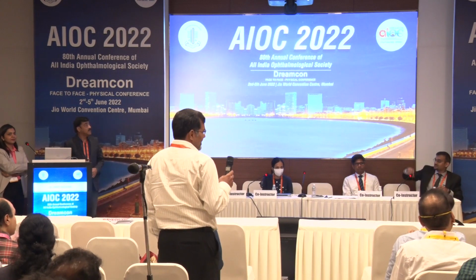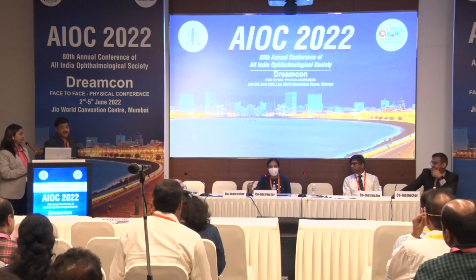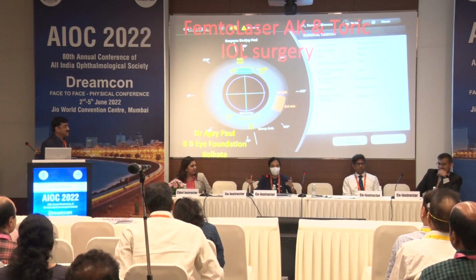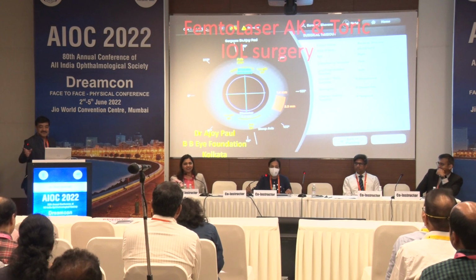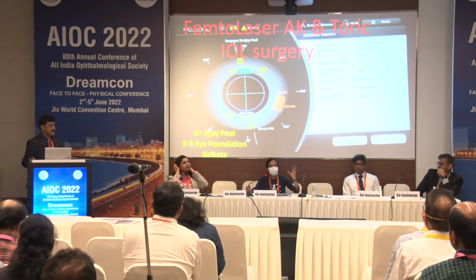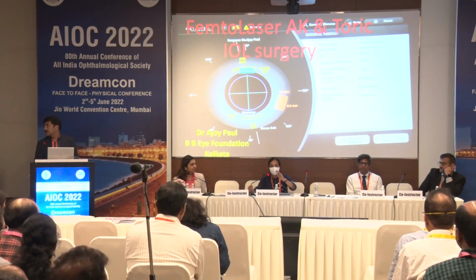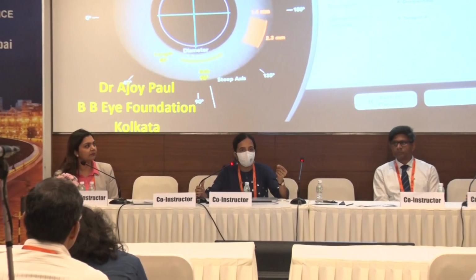You can have that. So I think there is good news in that sense, because there are so many instruments, and you don't just buy an instrument for the posterior cornea. There are many factors you consider when you buy a topographer. But the good news is that there is a study which showed Barrett Universal formula with predicted posterior, that means what they normally do, versus IOL Master measured. In fact, the predicted was, if not a shade better, then not inferior.